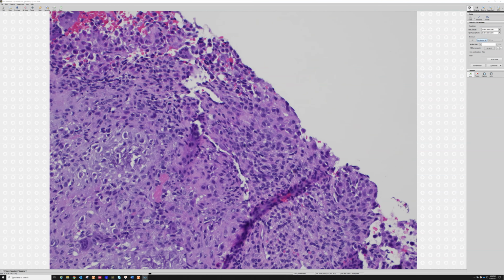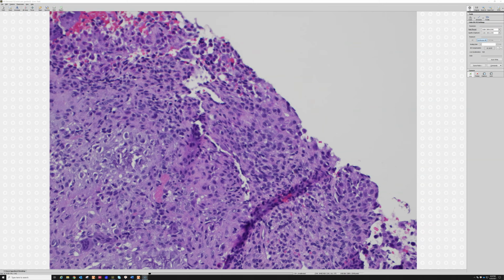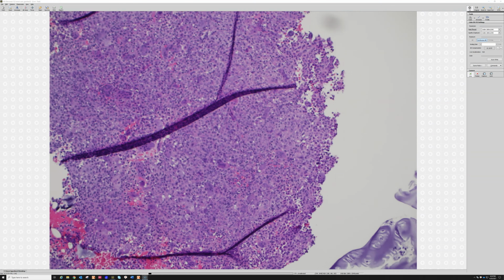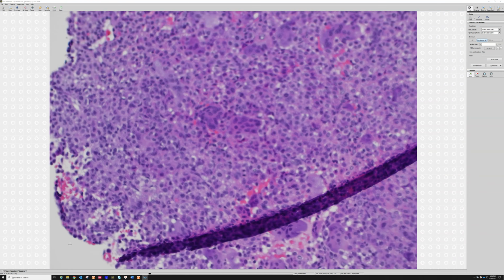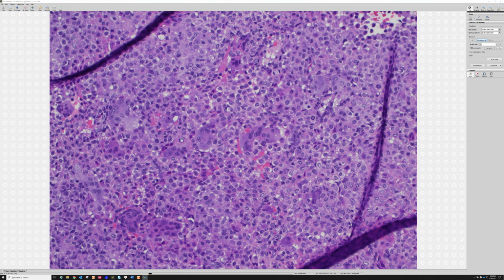And then again, you're going to have sheets of these bean-shaped or coffee bean grooved nuclei in the background, often with scattered giant cells like here. That can actually lead people sometimes to mistake this for a giant cell tumor, because there are multinucleated giant cells and mononuclear cells in between. That could resemble a little bit giant cell tumor of bone.